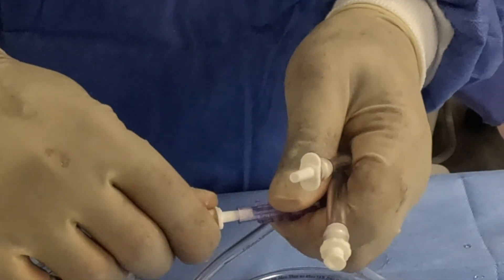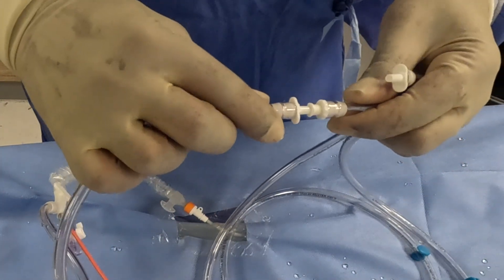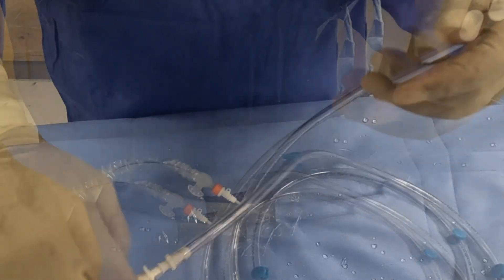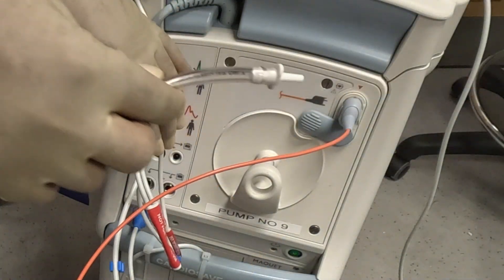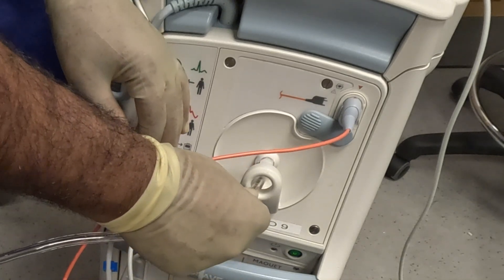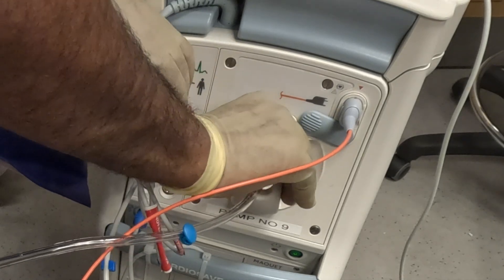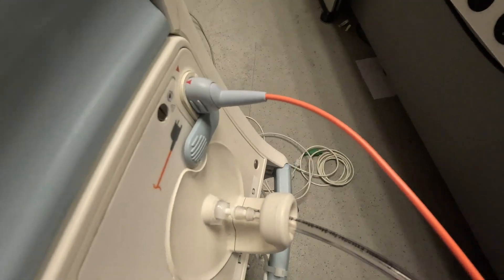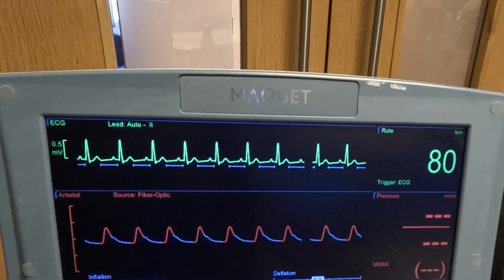Once positioned, disconnect the one-way valve from the intra-aortic balloon catheter. Connect the female end of the gas extension tube and pass the male end to the perfusionist. Connect the intra-aortic balloon catheter to the console. The tip of the balloon catheter should be positioned just distal to the left subclavian artery, and the base of the catheter above the renal artery. ECG signal is commonly used as a trigger.